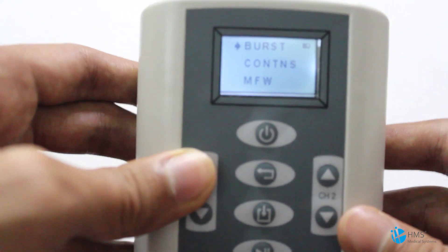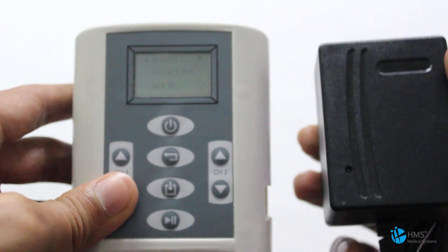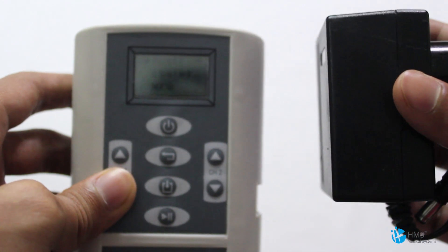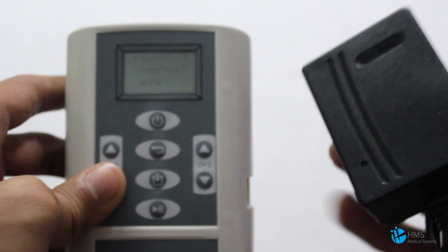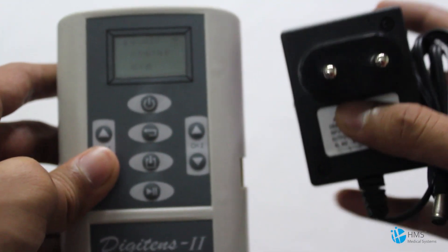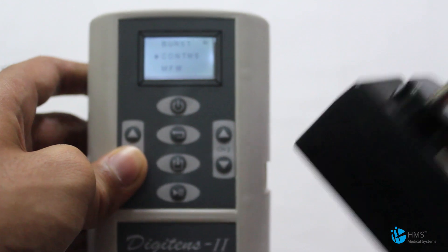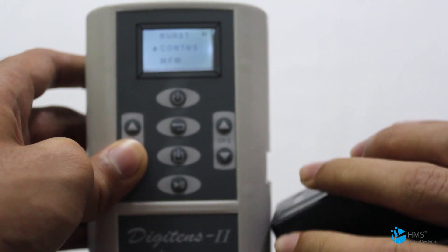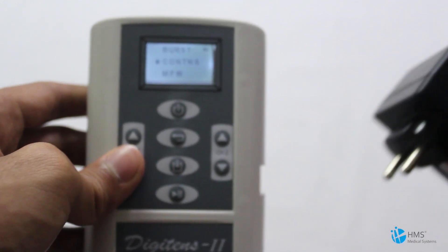This machine can also be operated using the adapter, which operates on both 220 and 110 volts and can be used anywhere around the world. As soon as you insert the external power adapter, the machine converts to operate from the external power supply and cuts off the power draw from the battery, so it's very convenient to use.